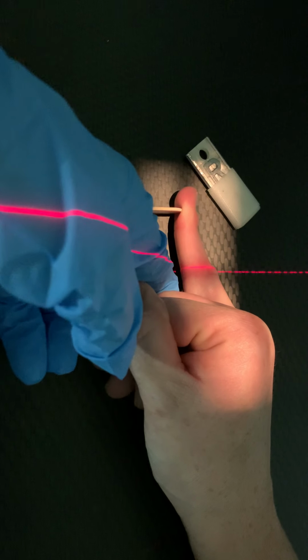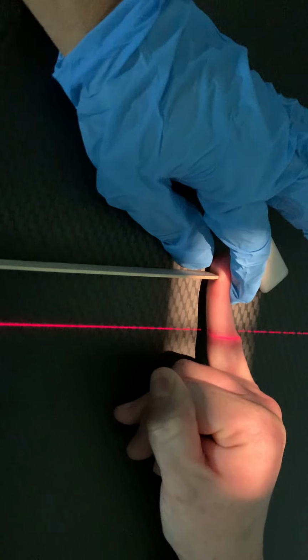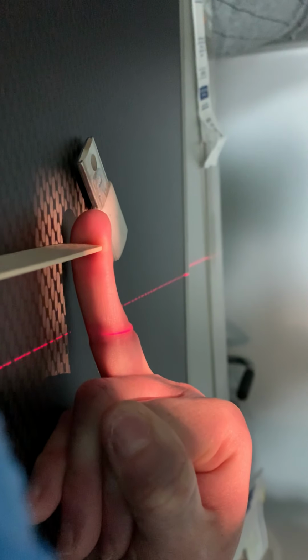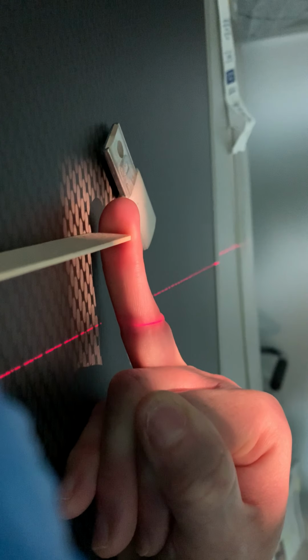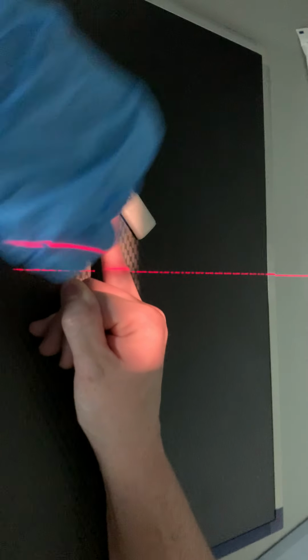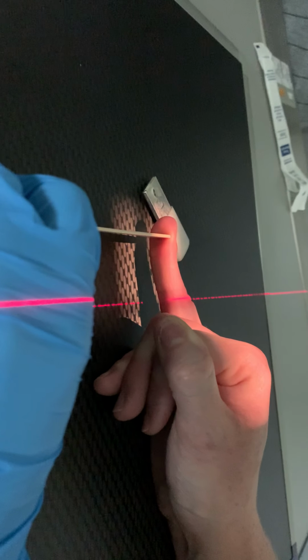And if you need to, try to use tape to tape her other fingers down. If you can see right there, you can see there's an angle on the tip, and that's because the finger is dipping down, so that joint space would be closed. So what we need to do is we need to lift this finger up to get it on the same, can you keep it straight out just like that? At that height. Kind of got to lift it up some. There you go. That's going to be better. That's going to open that joint space up for us. All right. And then just push it back. Just like that. All right.